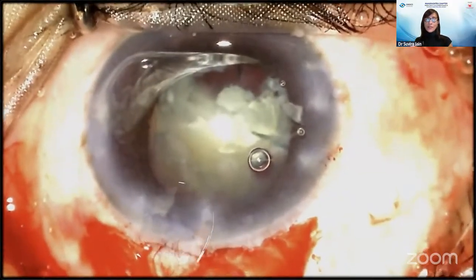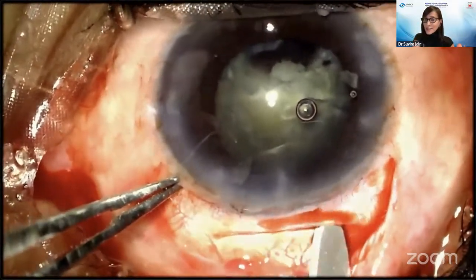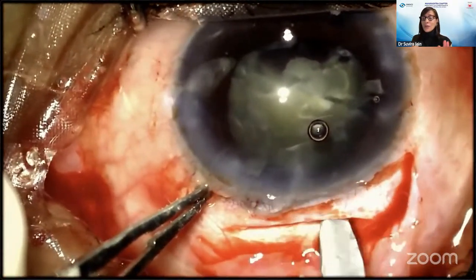Now, I'm a superior sitting surgeon. That was my position, my main incision being left-handed. It's at the 65-degree angle. I also like to therefore make my tunnels in the superior plane.